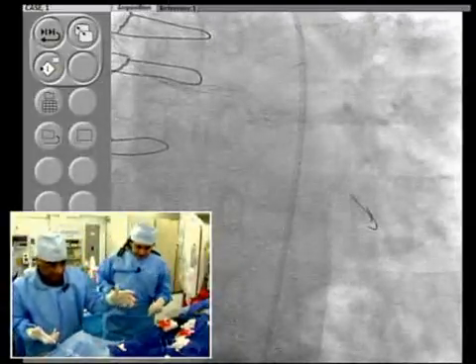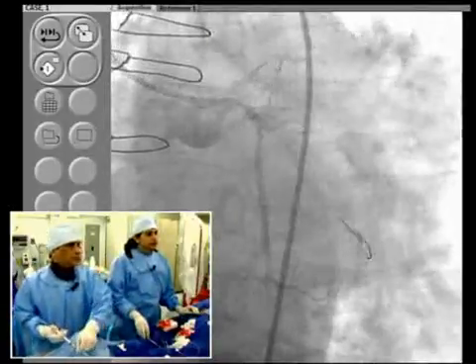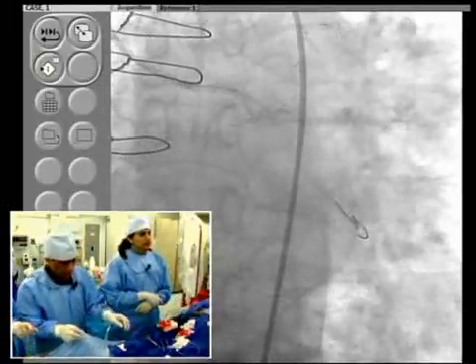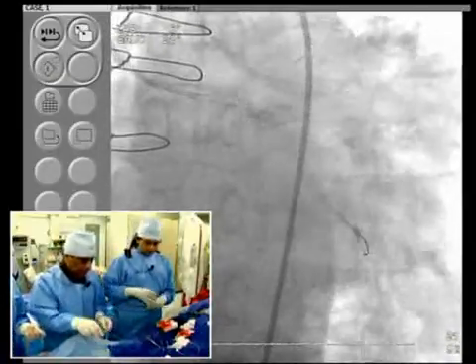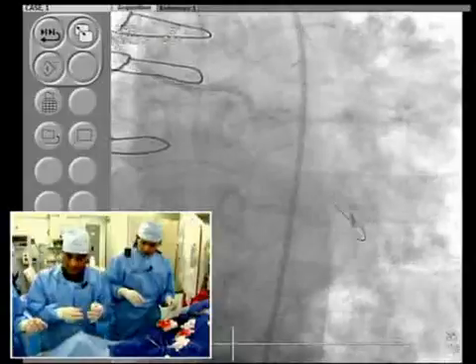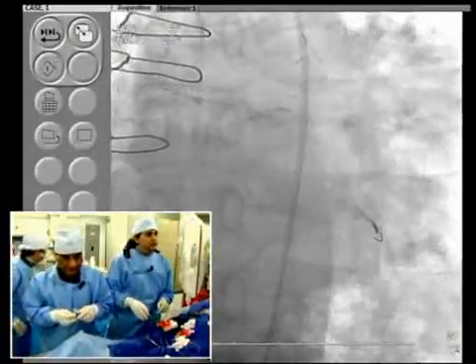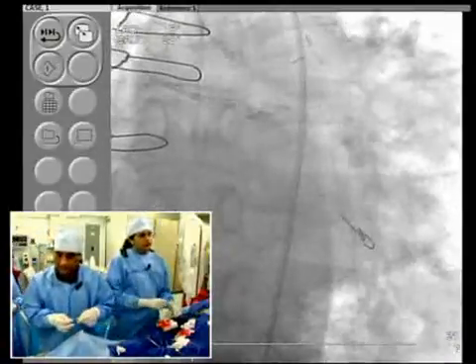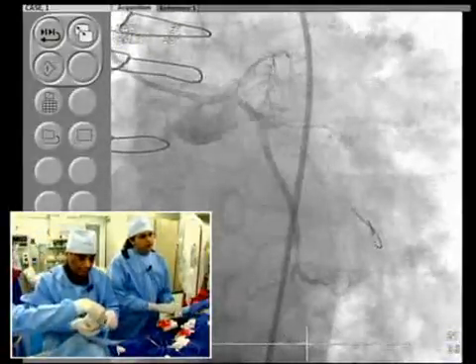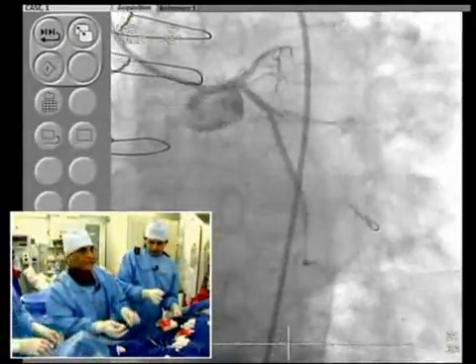Have you had cases where you would high pressure inflate only a part of the longer stent? Many of them, and particularly with the Zions, knowing that it's the same stent, you do not worry about the various cell sizes, so it's completely fine. It's the balloon which determines it, whether it's a 2.5 or a 3.0. And you've had a chance to look at it with the IVUS to see that proximal half, even with the stent boost.